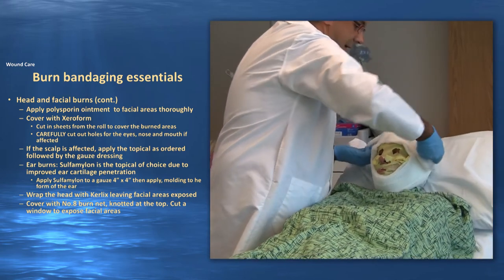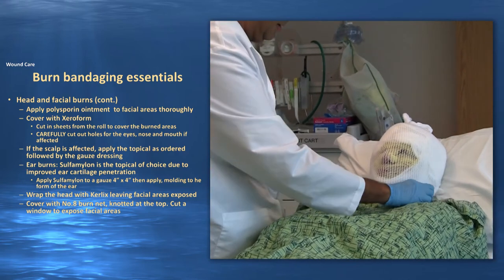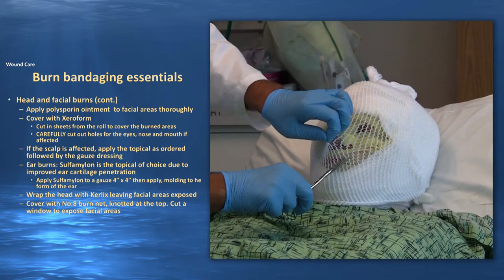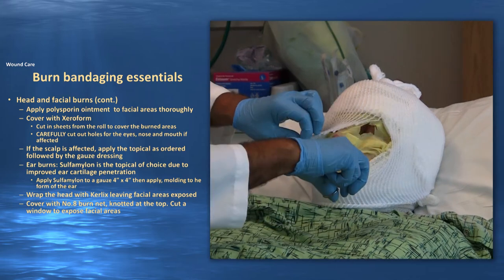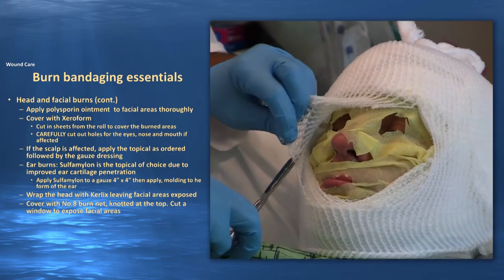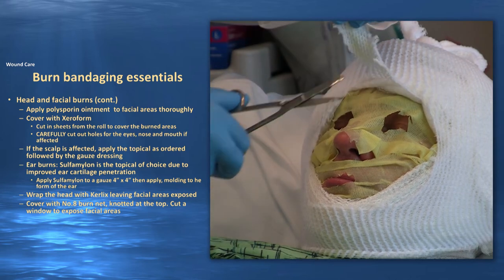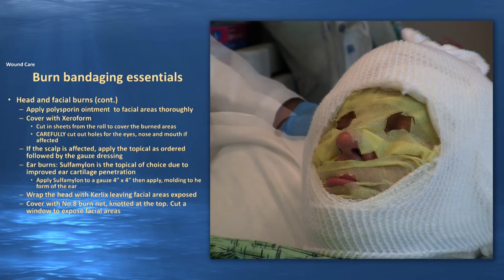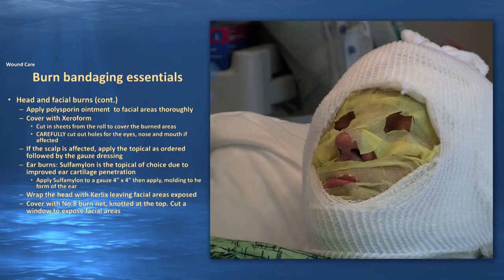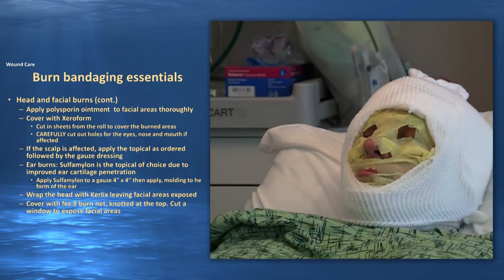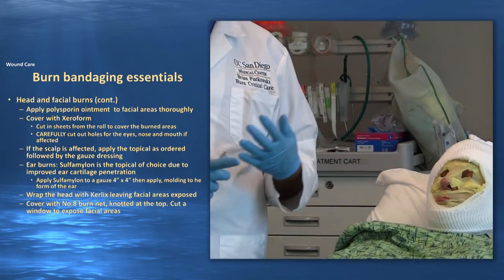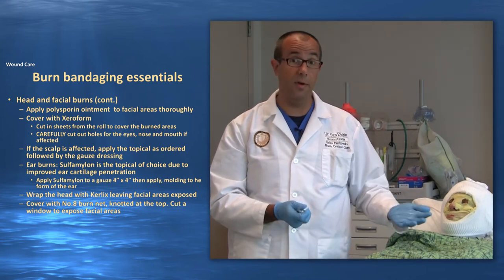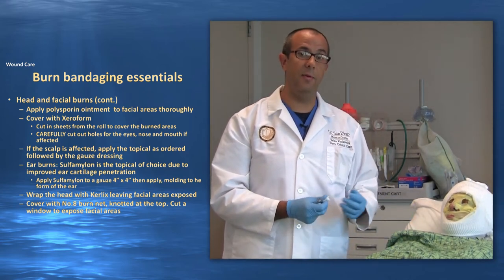Follow up the Curlex wrap with stretch netting — tie a little knot on top for closure and slide it over the top of the head and down over the face. Then cut a small window in the netting for visibility, taking just enough off to give them a window without losing the integrity of the netting that keeps the dressing intact. That is how you do a head and face bandage. The reason we put Xeroform over the polysporin is twofold: it keeps dressings from sticking and maintains a moist wound environment so facial burns don't dry out.